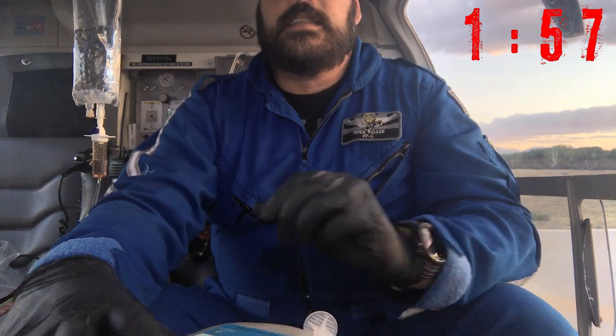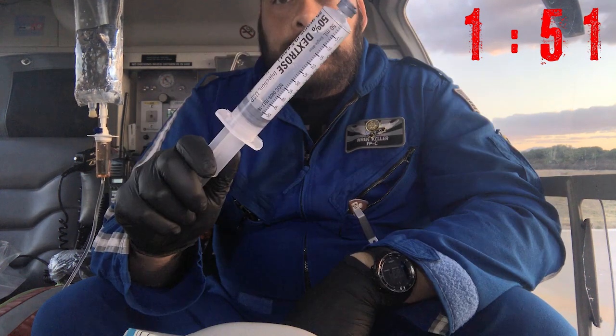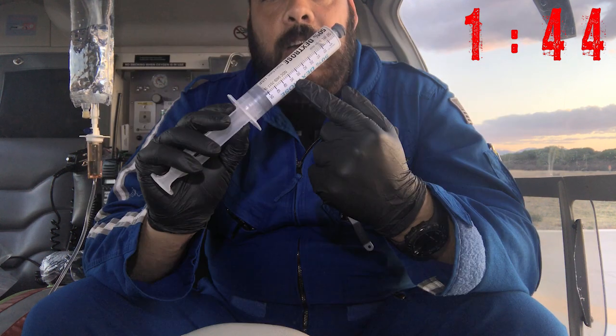Today's two-minute tip. Let's say that you have D50, but what you really need is D25 or even D10. First, take note of the graduations on your BristaJet — some show how much you've given and some show how much you have remaining.